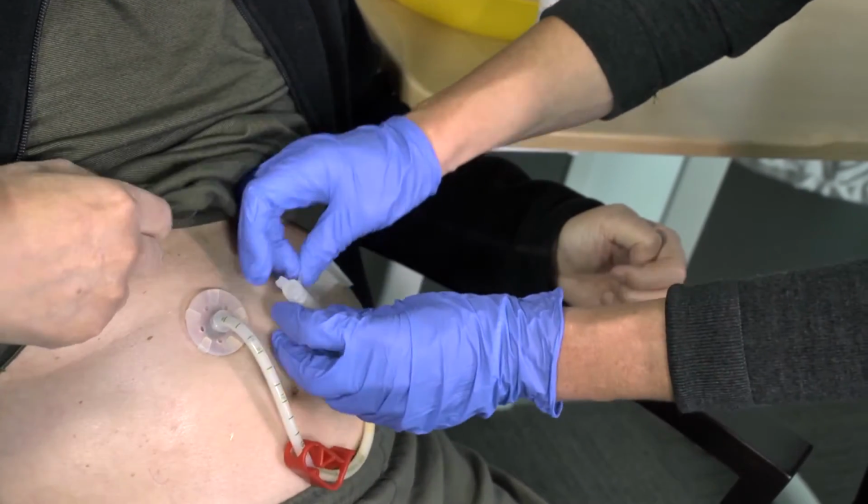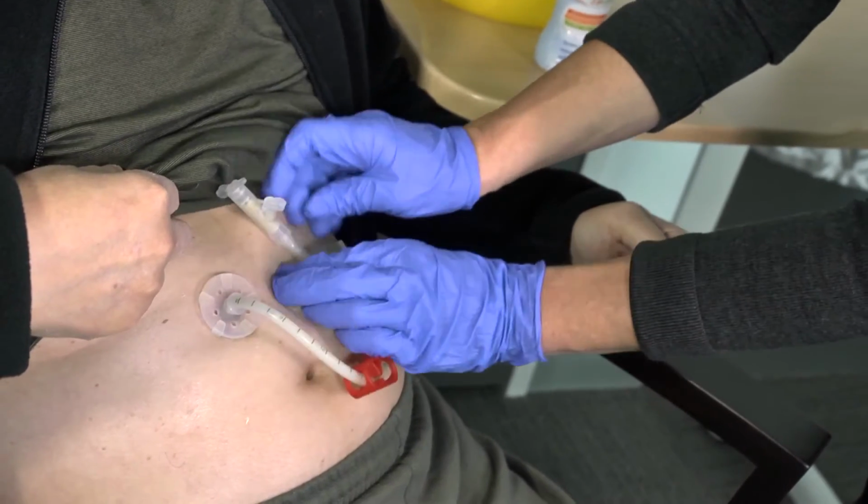Your dietitian will tell you how much water to use. It should take approximately 10 to 15 minutes to give a feed.